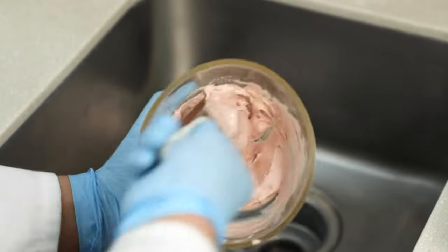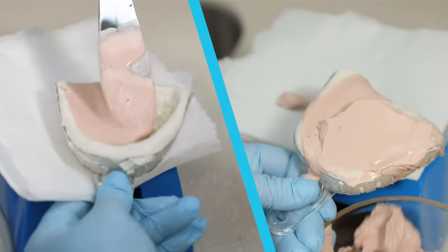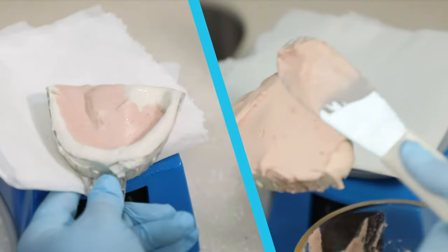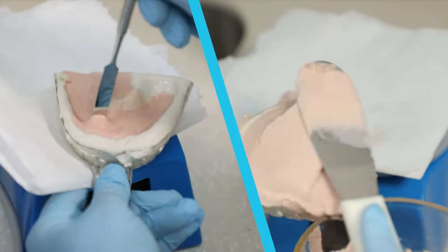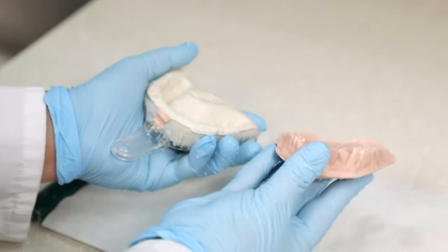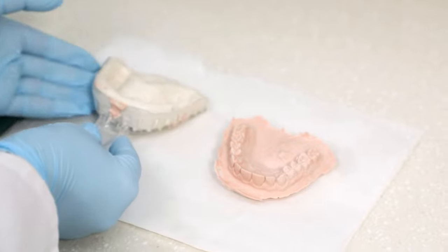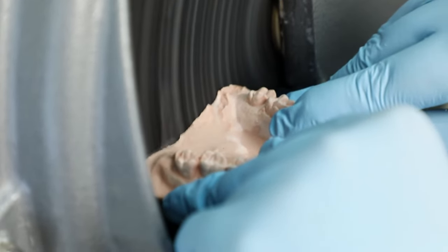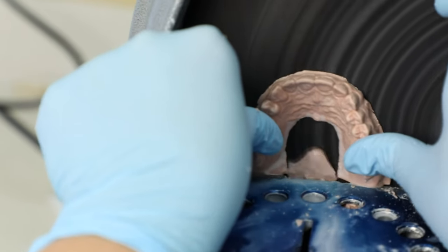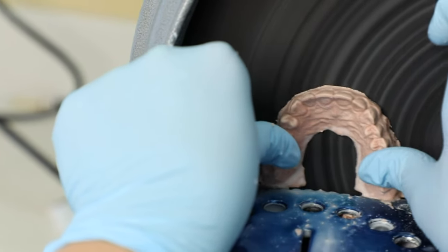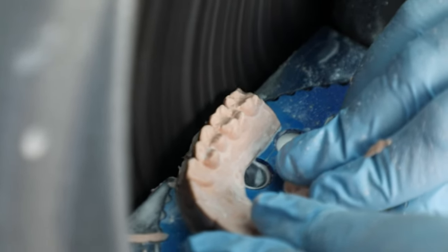Pour impression with fast-set plaster or dental stone. Pour alginate shortly after making impression to ensure accuracy. Trimming is less work if quantity of stone is kept to a minimum. Pallet and tongue areas are not poured or should be removed after plaster has set.